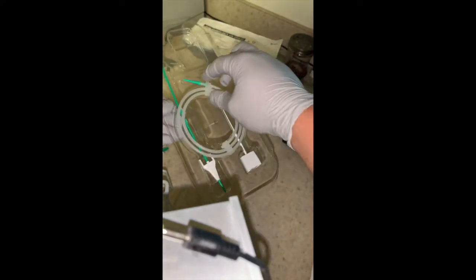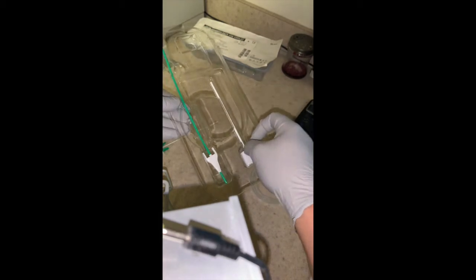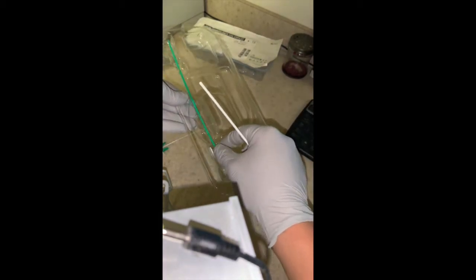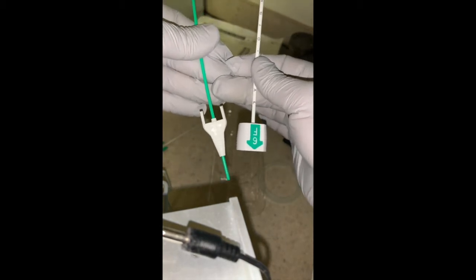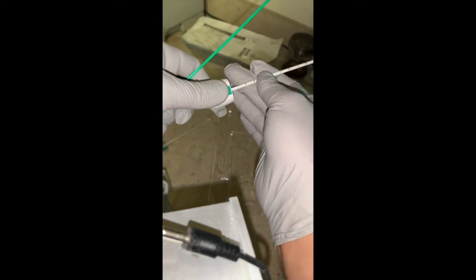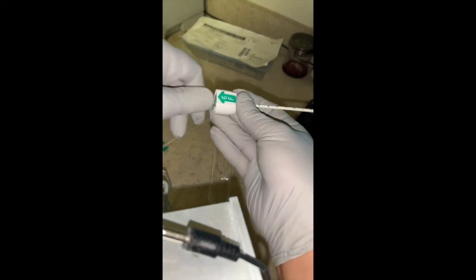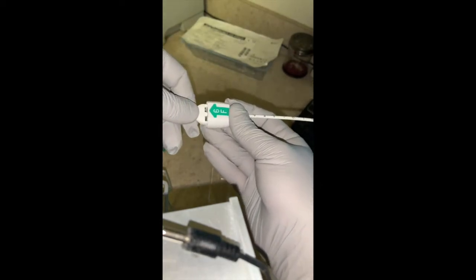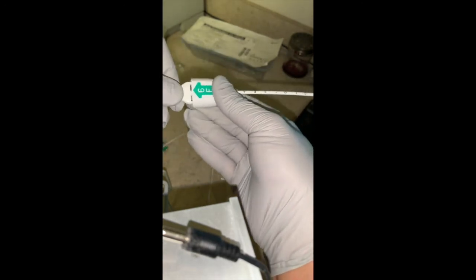Get ready to perform an Angiaseal closure. You take these two parts and make sure that the markings on them are facing the same way. You merely insert one part into the other, and as you do so, there's going to be a slight click as it is inserted.